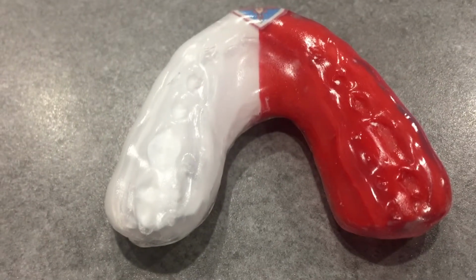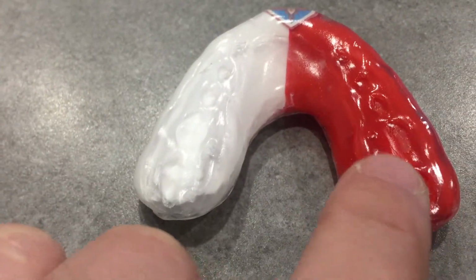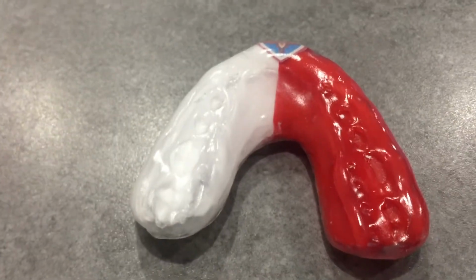Looking at my custom mouthguard, you can see more of the same here, so there's quite a good seat for each one of these molars to fit into, and there is more contact on the anteriors here. You can see that they have a spot to fit in here as well. So as far as the biting surface goes, the boil and bite actually hasn't done too poorly of a job, but the custom mouthguard is still ahead of it.